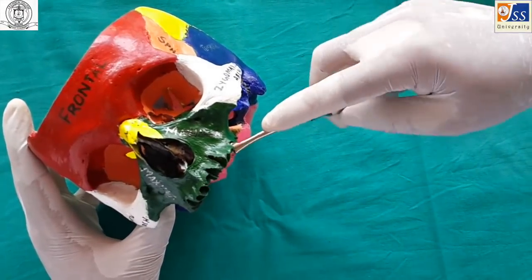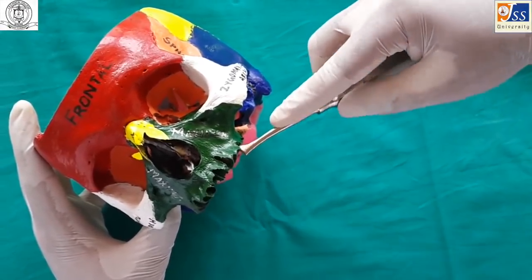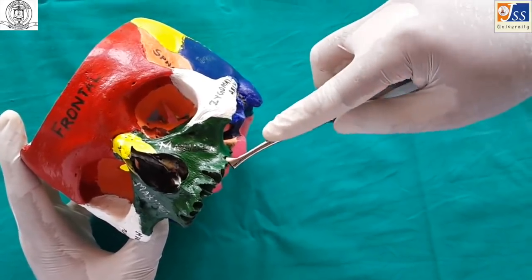Cryer's elevator is used for extraction of maxillary teeth. It is useful when one of the roots has been removed, and the elevator is used through the socket of that root to remove the other roots.